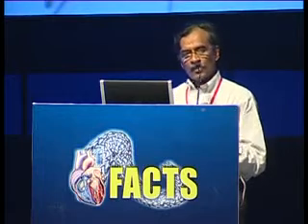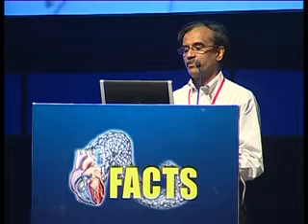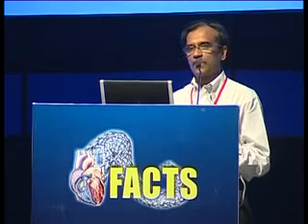To avoid this, the most important thing is, whenever we access the femoral vein for the technique of mitral commissurotomy, it's very important to remember to access the femoral vein in a vertical fashion and shorten the distance of the subcutaneous tunnel or the tissues which the catheter has to traverse.